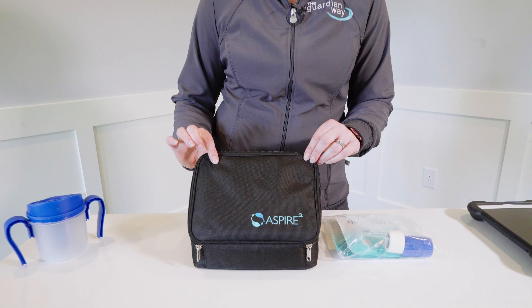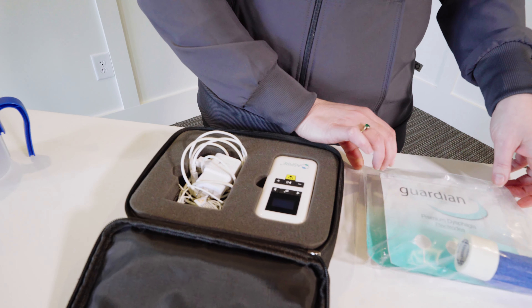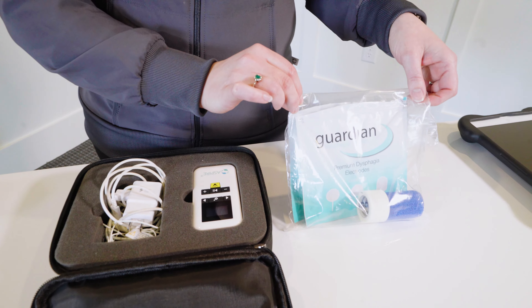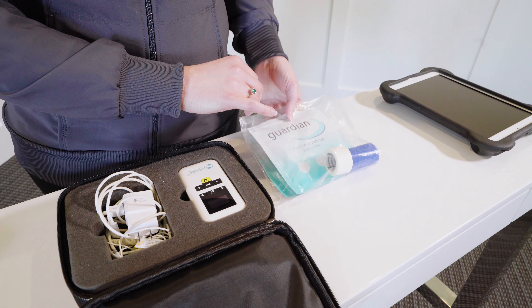When you open up your box, you're going to find the device in the padded cloth case and you'll also have a bag of accessories with your electrodes and additional items needed for practice.